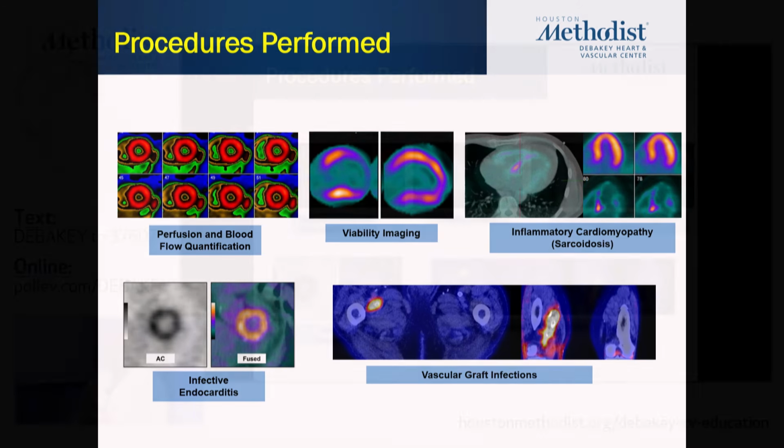And then they've got another question here. Will PET CT take the place of indium-labeled white blood cell scans for infected graft workup, in your opinion? So I think we don't have a lot of data comparing it. The study that I can tell you about is looking at cardiac infections. And in these studies, when they compared them head to head, PET CT actually was more accurate in these patients, and that's using FDG.